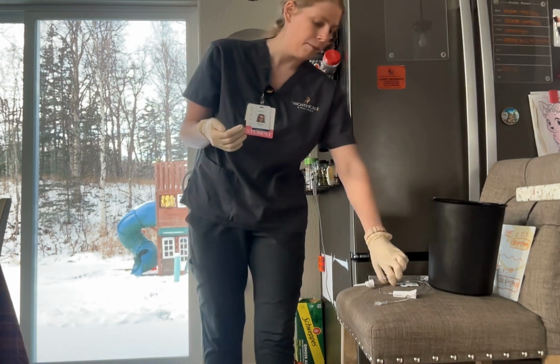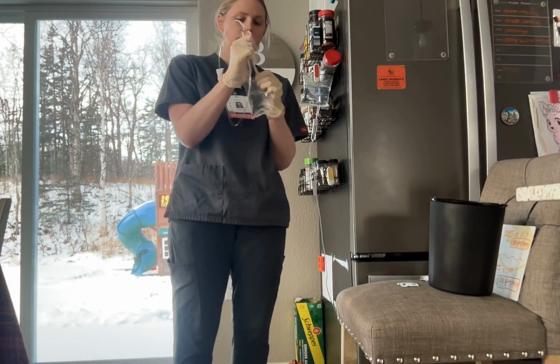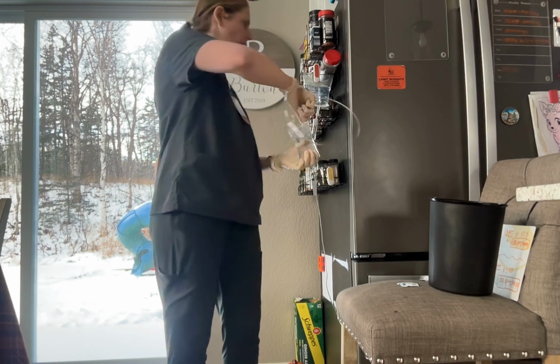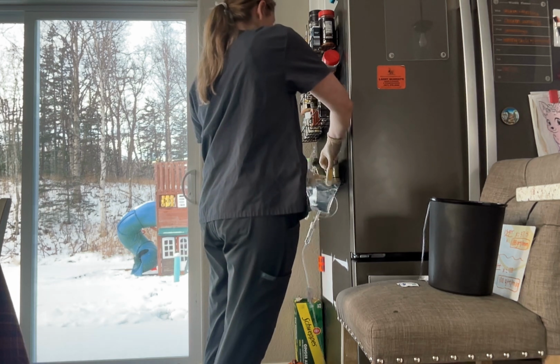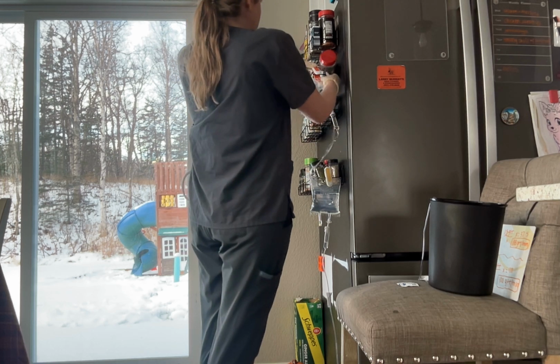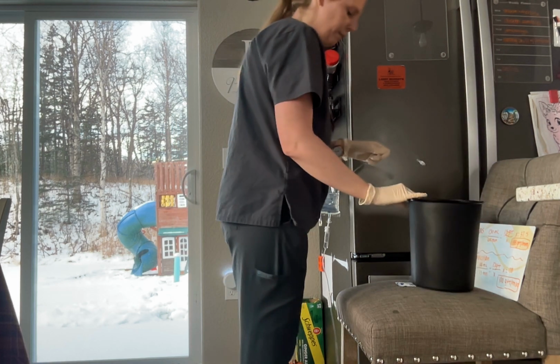So now I'm going to take our secondary tubing and spike our bag here. Okay, and now because this is going to be the medication, we are going to move down our primary fluid here, and we are going to place the piggyback, which is the amoxicillin, 30 inches above the patient's IV site. So now I'm going to prime the tubing before I connect it.